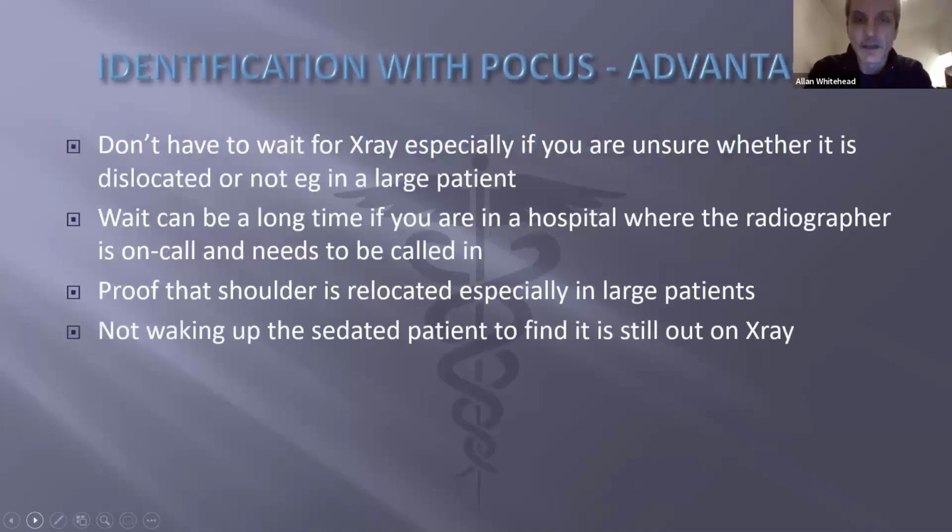There, it's working now. Okay, so obviously, again, this is going to depend on where you work. If you're in a large hospital or a tertiary center, you'll always have a radiographer available, and you don't need to wait for that in principle. But as we know, sometimes they're very busy, and that's going to still cause a delay. So that's one issue, having to wait for an X-ray, even if there's a radiographer there. Or if you're in a small hospital, they might be on call all the time, or even just some of the time, particularly after hours. And then it's going to cause a delay if you've got to wait for an X-ray.